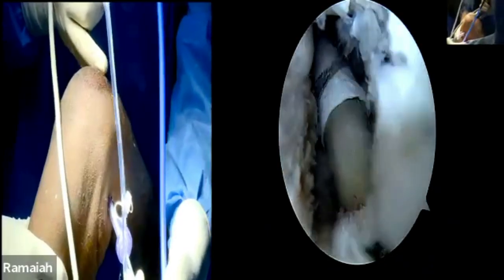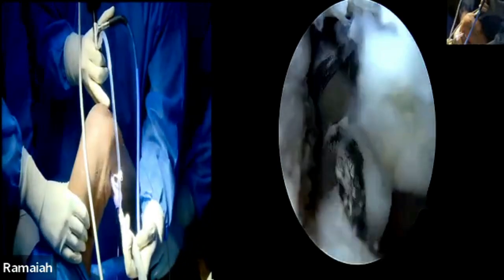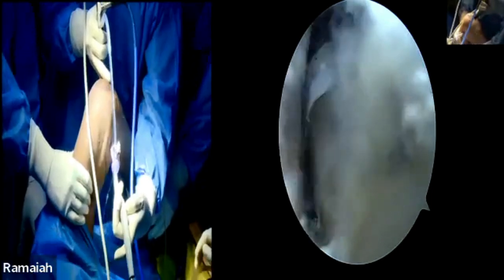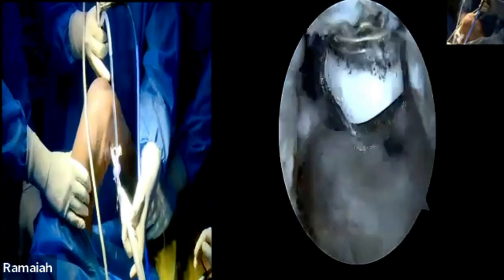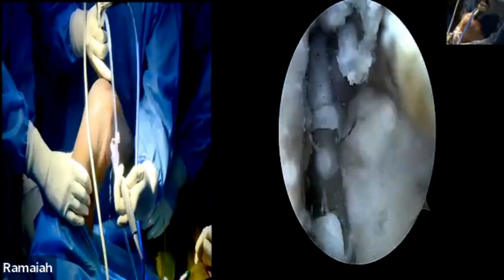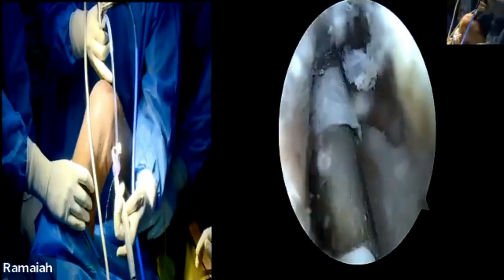I've just harvested the graft for the PCL reconstruction. For understanding purposes, I have not harvested a bigger graft — I've just harvested one graft. The basic idea is to show the technique because it's a cadaver demonstration. Right now I'm just preparing the bed where the guide wire has to come.